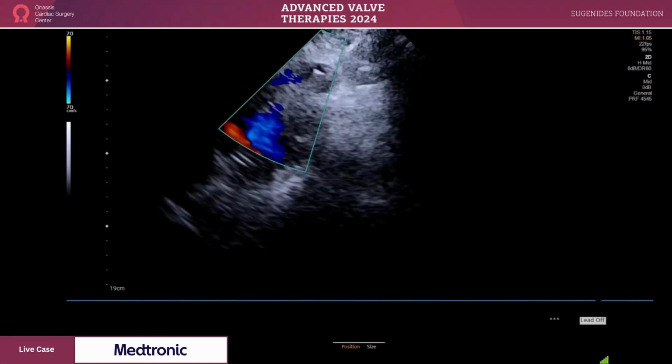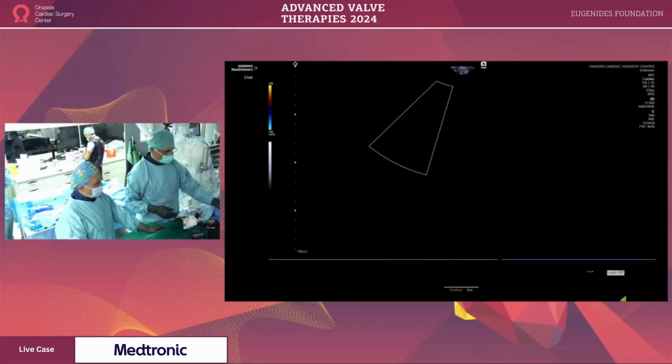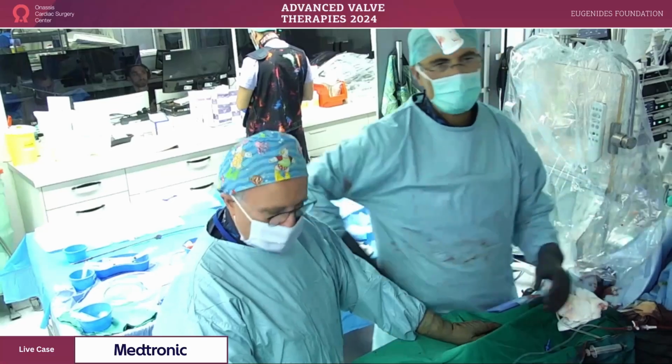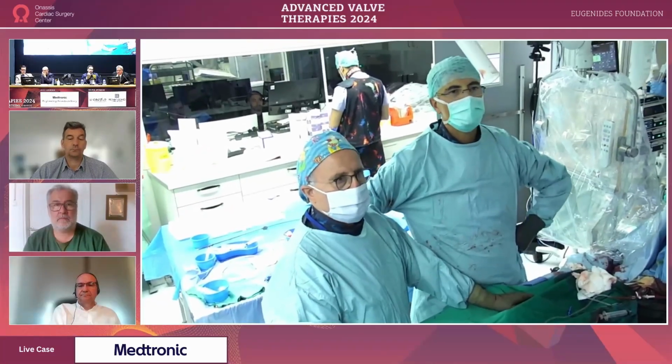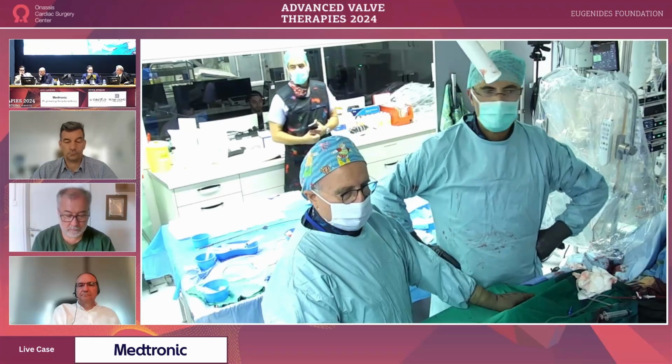I think we're fine. So there's no need to do something else. Do you have any other questions? You want to do another aortogram, or we're just fine with that? I think we gave a lot of dye, more than the amount that we anticipated.